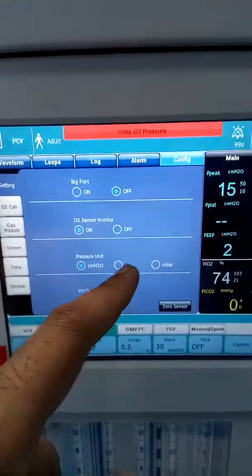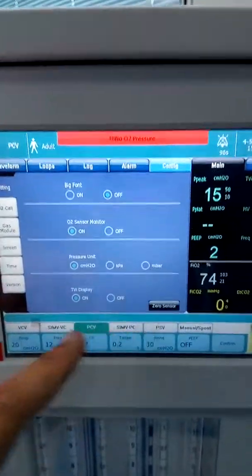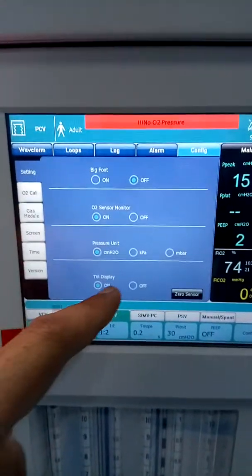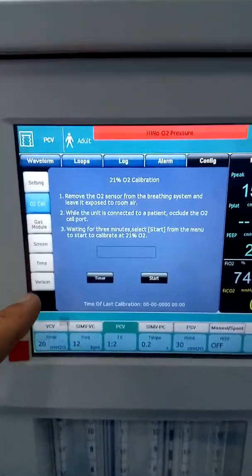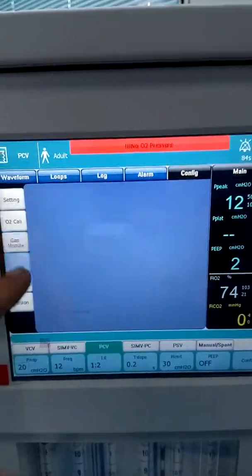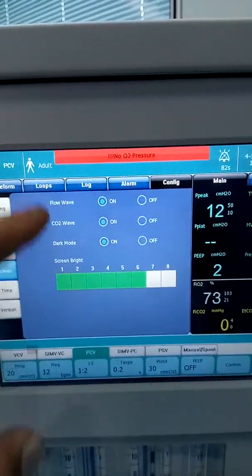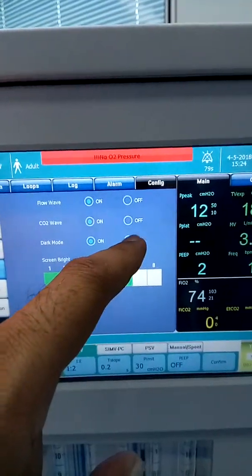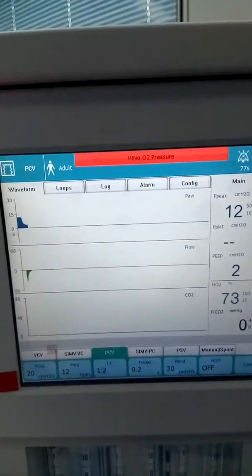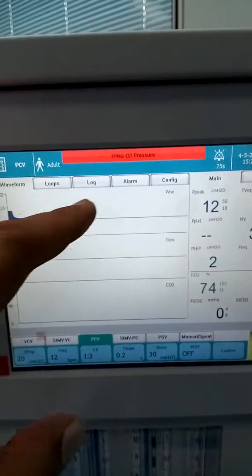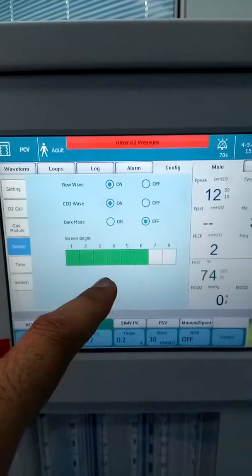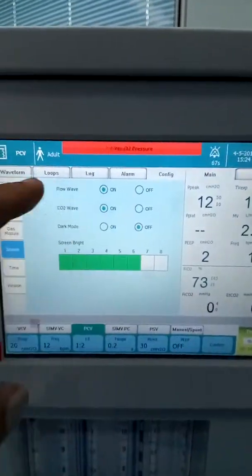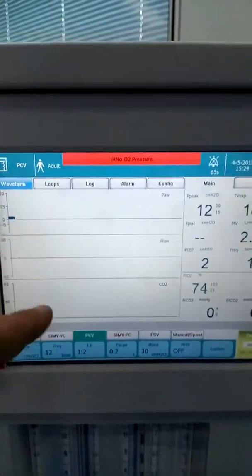You can set the pressure unit to cmH2O or kPa, and other settings here. These are settings for calibration of the O2 cell, gas module, and CO2 module. You can choose which waveform you want to see. There are two display themes: dark mode and light mode. Currently this is the light theme.